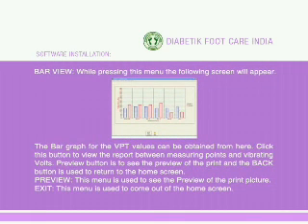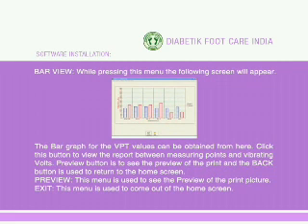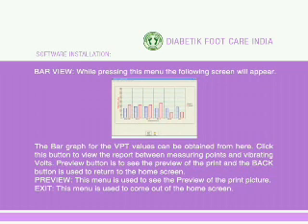Bar View: While pressing this menu, the following screen will appear. The bar graph for VPT values can be obtained from here. Click this button to view the report between measuring points and vibrating volts. Preview — this button is used to see the preview of the print, and the back button returns to the home screen. Exit — this menu is used to come out of the home screen.